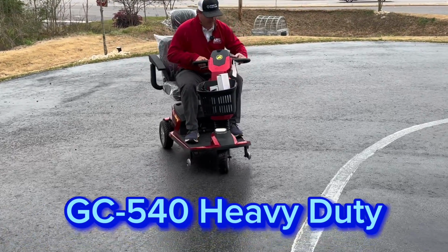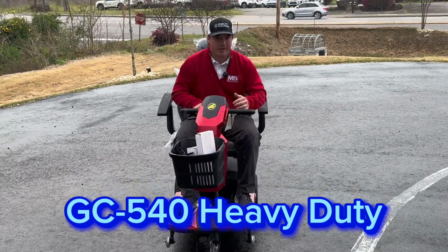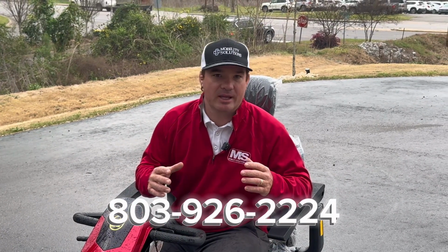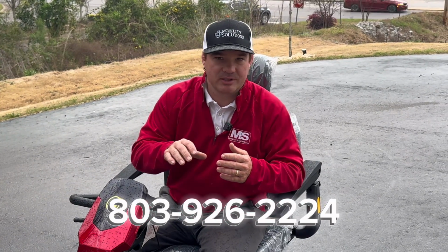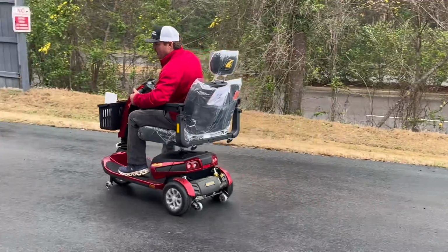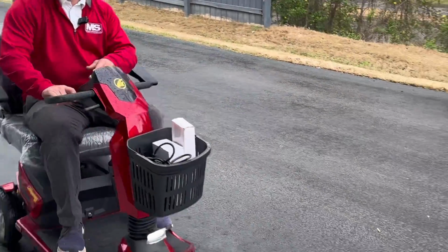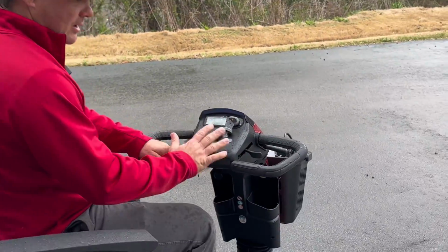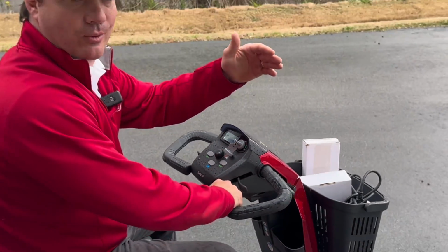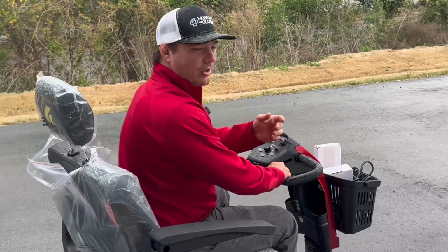And I'm not too worried about it. Water resistant push buttons on here. You're going to get caught in little rains like this. It was sunny, it was nice, and all of a sudden the rain just decided to come out. And you really can't fault someone for getting caught in situations like this. Now, if you do get caught in the rain, you don't want to go through puddles and stuff. Try to avoid them, which you should be able to. But this little bit of light rain, I'm not worried at all about it. Because of the new water resistant dashboard they came out with to protect this, I wouldn't say go out in a heavy rain, but if it starts to rain on you, don't be too alarmed.